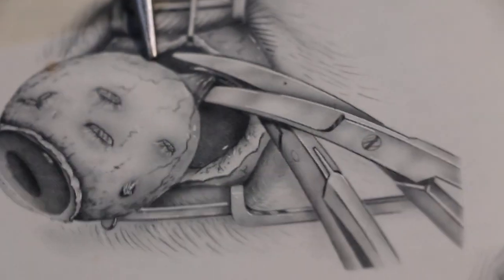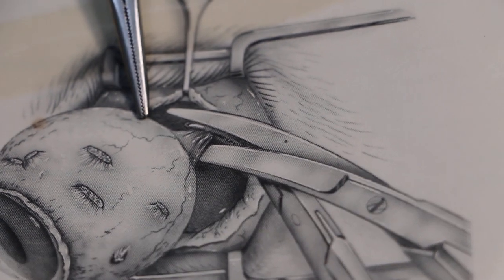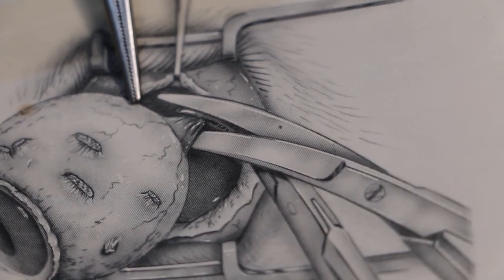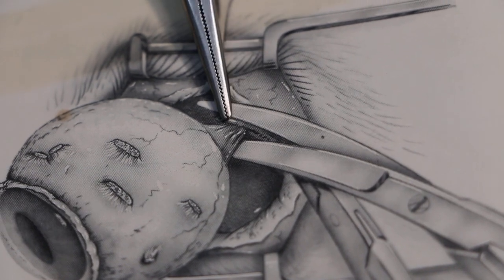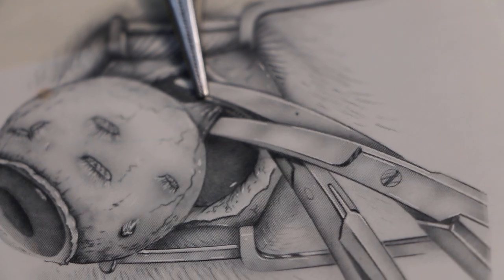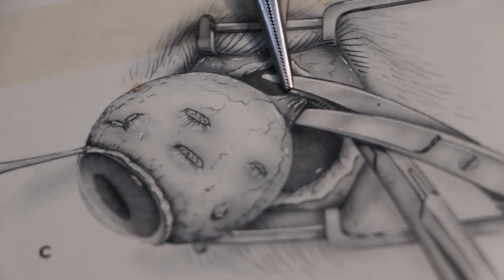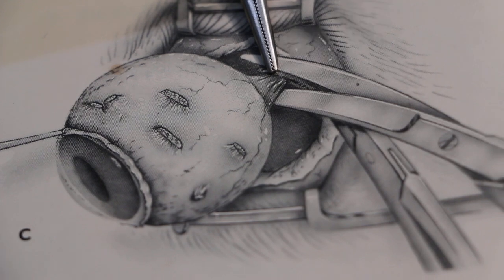As shown in the drawing, scissors were used to cut the optic nerve and blood vessels, but I ligated it underneath instead. I don't use scissors or forceps — I ligated it so that all bleeding stops when I cut off the eyeball at the optic nerve area, above the ligation.